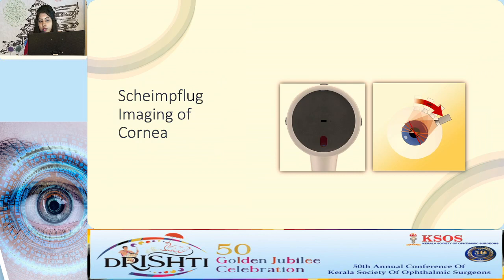So essentially in a Scheimpflug imaging system, there is a camera which rotates 360 degrees around the cornea, and it also has a blue light of nearly 470 nanometers to illuminate the cornea, and it takes around 50 scans in 2 seconds. A total of 25,000 elevation points are taken.